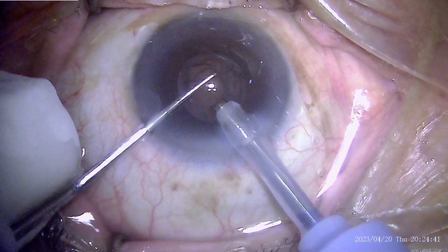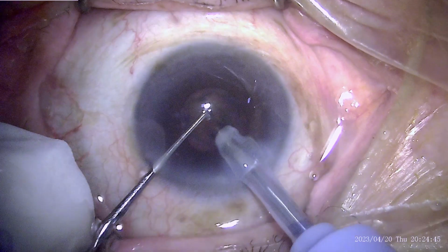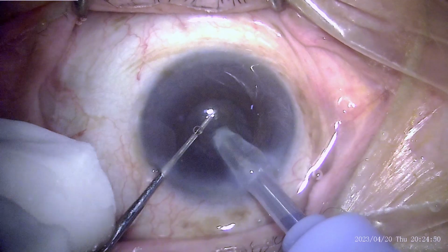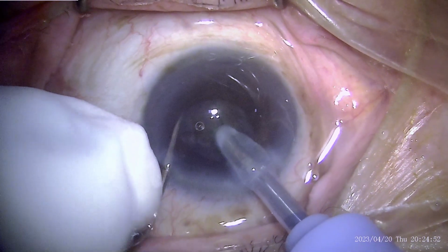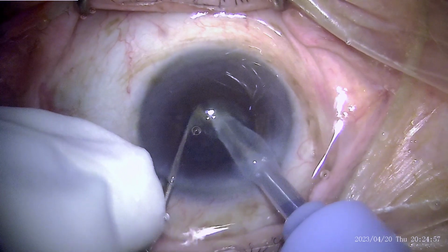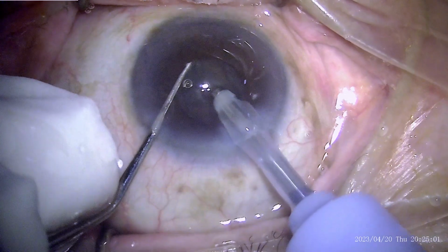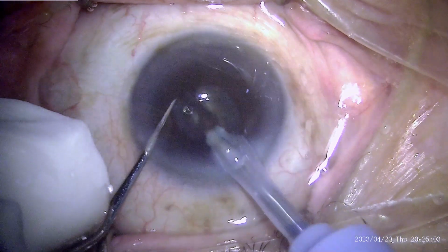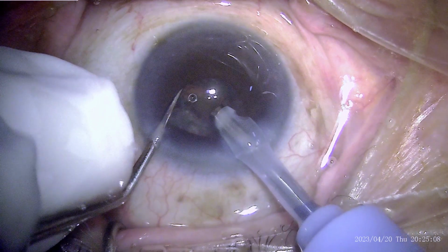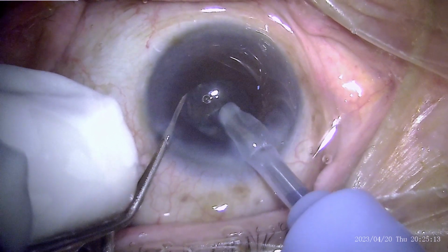Removing the overlying cortex and then going for the direct horizontal chop. Again, the issue is that one has to approach up to the equator of the lens and then squeeze or lacerate the nucleus and separate the pieces. Here we can see this has been done, and it's a full thickness chop, and we now rotate the nucleus. During all these maneuvers, it is very important to have very good foot switch control and a machine which can provide a stable chamber.